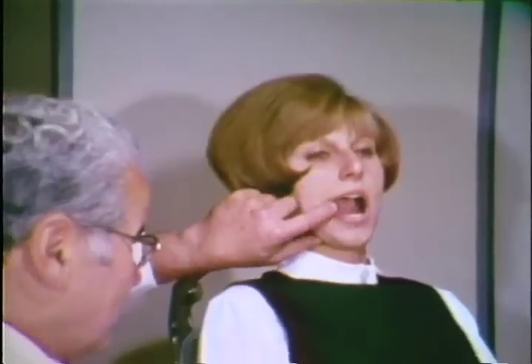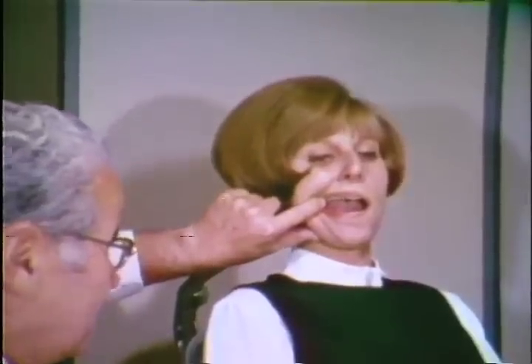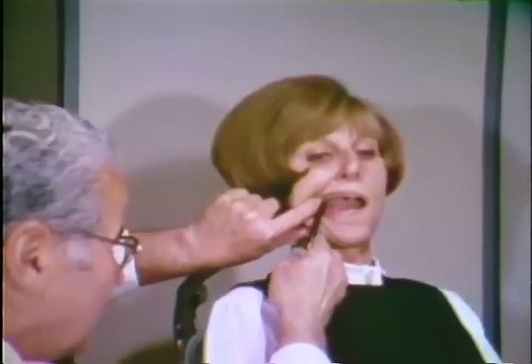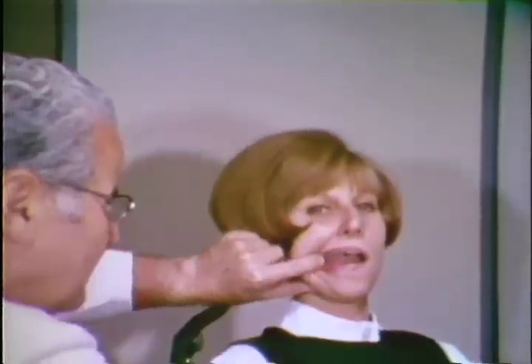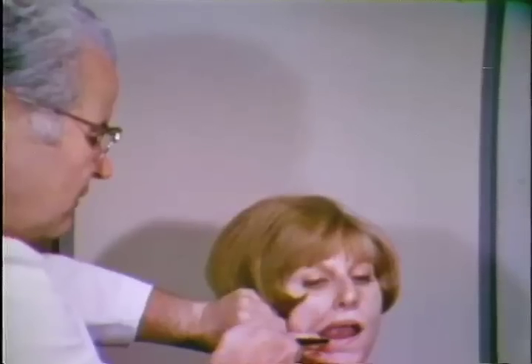The line of sight is a distinct aid in directing the X-ray beam. If the examiner positions his eye at a location that permits him to see through the interproximal spaces of the posterior teeth and then directs the X-ray beam in the same direction, no overlapping of proximal surfaces should occur in uncomplicated cases. Both upper and lower segments should be visualized. A guide for determining this proper direction is illustrated on this model. The direction of a line passing through the red marks on the tips of both cusps of the second bicuspid will be optimal for seeing through most of the interproximal areas.